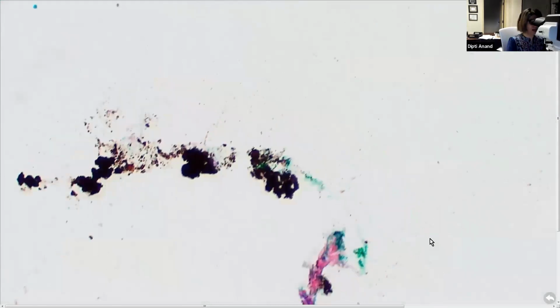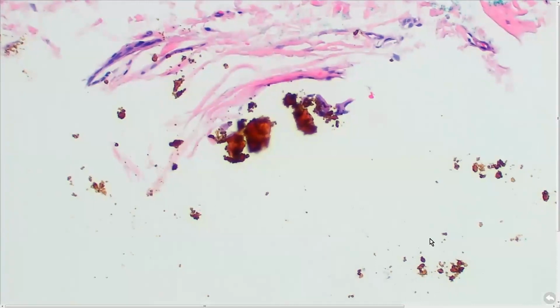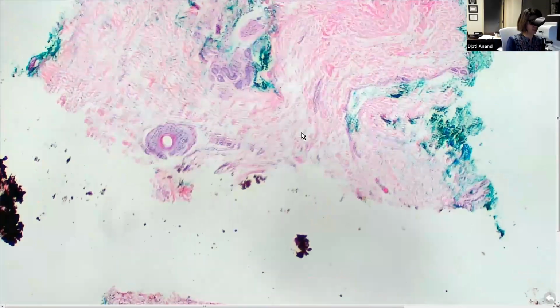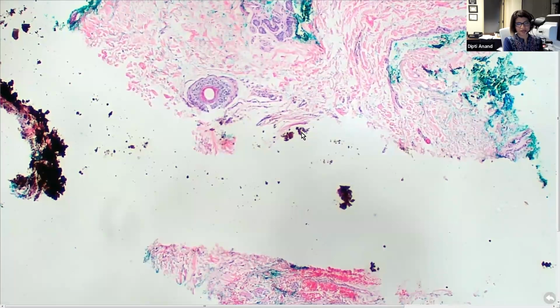It's actually a foreign body reaction to a metallic substance which has basically iron within it. So the important thing is to recognize this crystalline material which has this golden brown look, which is indicative of iron. So you see that over there. And believe it or not, it's not uncommon. We do see this, so this kind of material you need to recognize. It has a crystalline golden brown look to it, which is a metallic substance containing iron. So it is a foreign body reaction because of that, and that's why it's produced this kind of empty space in the tissue. That's because it was embedded and it could not produce an even section when the histotechs were trying to cut it. So this is your foreign body reaction from crystalline iron.